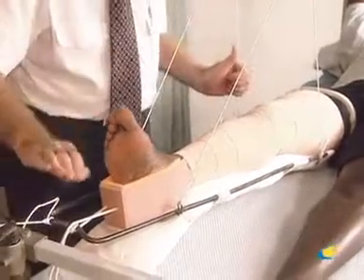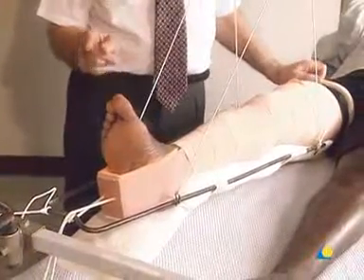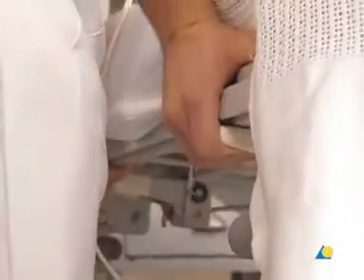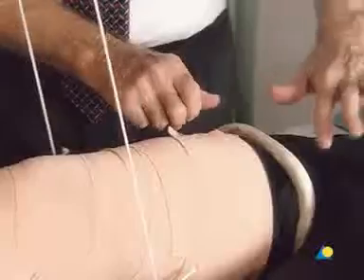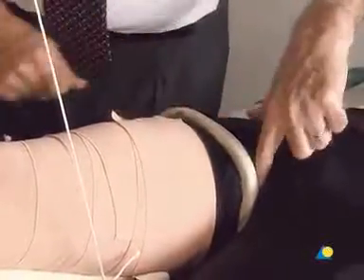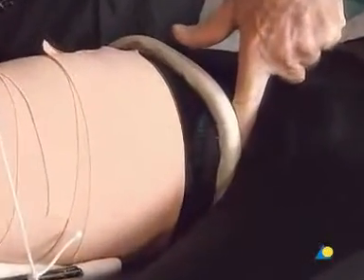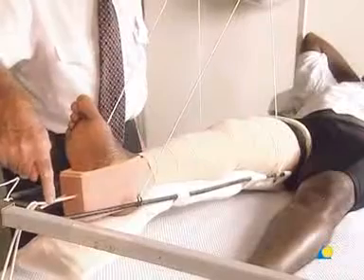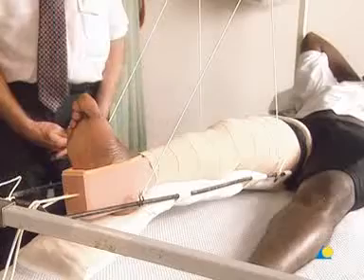In general, the weights at the distal end will cause the patient to slip gradually towards the foot of the bed. To prevent this slippage, the foot of the bed is elevated so that the weight of the patient balances the weight at the distal end. A finger is inserted between the ring of the Thomas splint and the groin to verify that there are no pressure points. If pressure points are found, then the traction caused by the cord which secures the elastoplast to the Thomas splint should be lessened. The application of the Thomas splint is now complete.